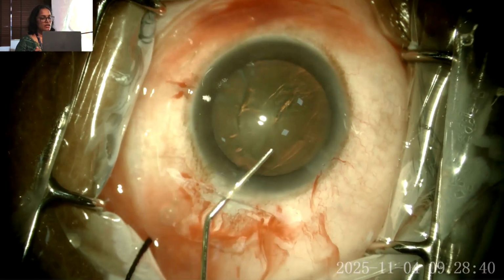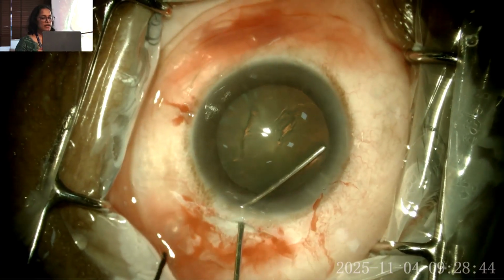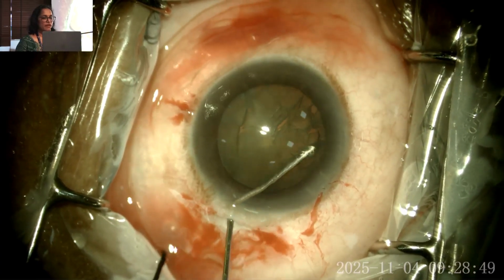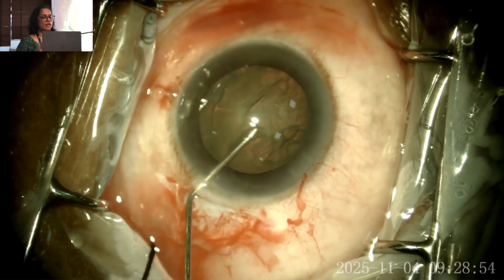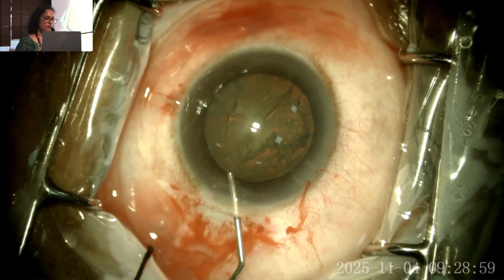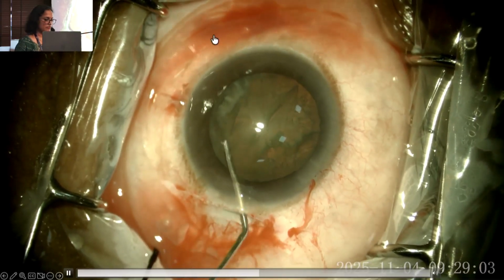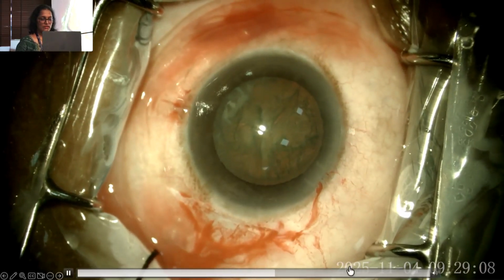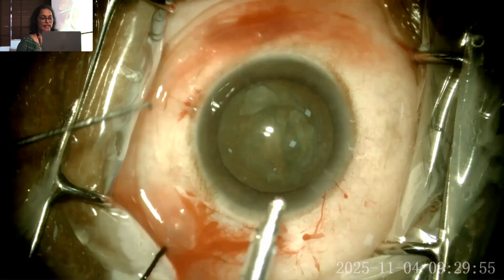One side, you can see the burping out of the visco and the anterior capsule. You can see the wave going. Also, make sure the hydrodissection is complete. If in doubt, repeat it on the other side. And rotate; the nucleus should rotate very freely in the bag.